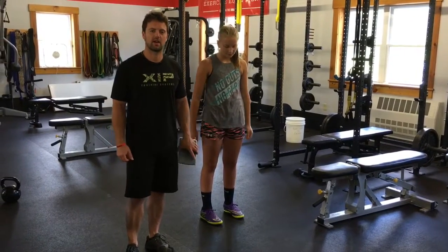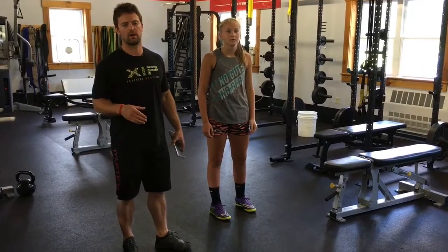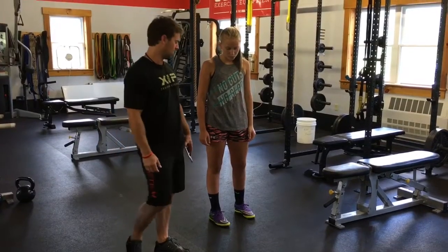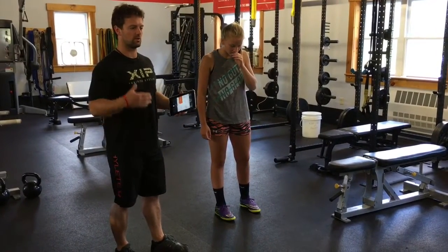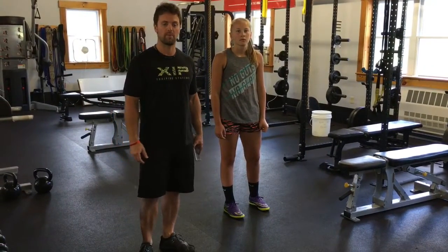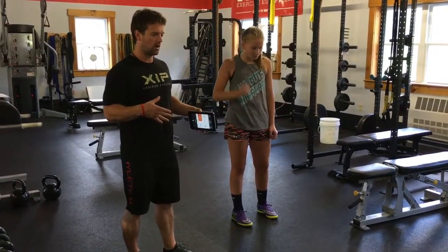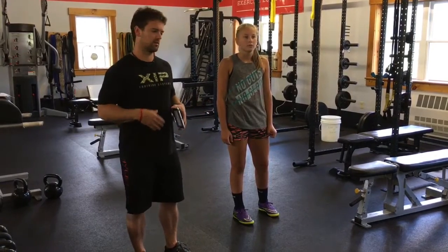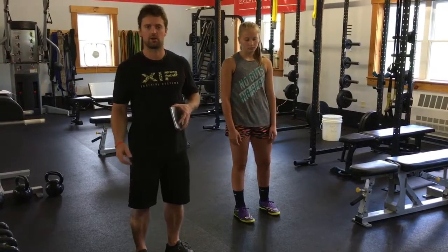Hey guys, Adrian here, XIP Training Systems. Today I'm going to show you how you can use your push band in the reconditioning process. In this case, we've got an ACL repair and we're trying to decide when this athlete is ready to return to play. Lindsay has just started getting more multi-directional, change of direction, some of these more reactive, ballistic type movements — she's starting to see those back in her training again.